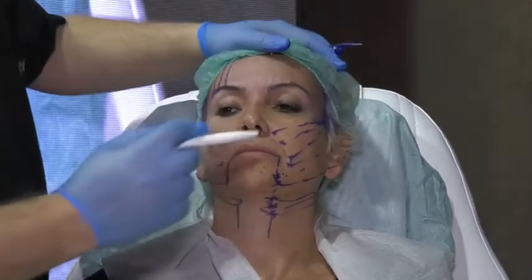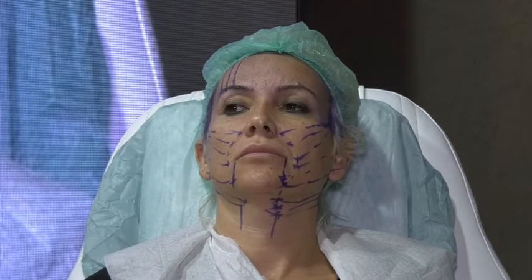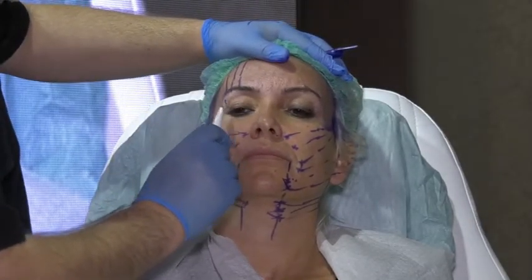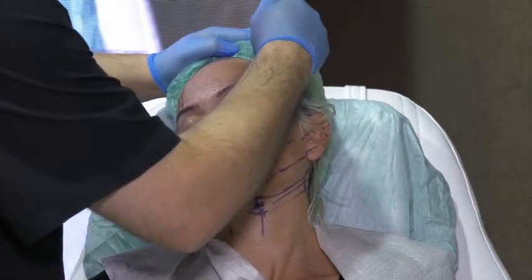Okay. When I put the eyebrow, I'm not gonna ask here again what you want because I know. I just try to find any landmark, so I do the same. For example, the last thread here was at the level of the lateral canthus. So the last thread here should be at the level of the lateral canthus. So this is 1, 2.